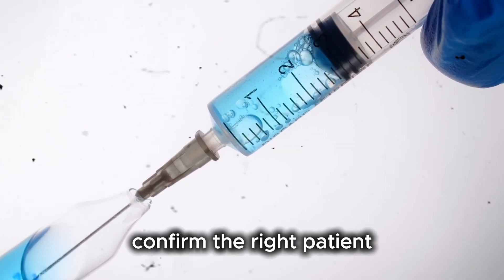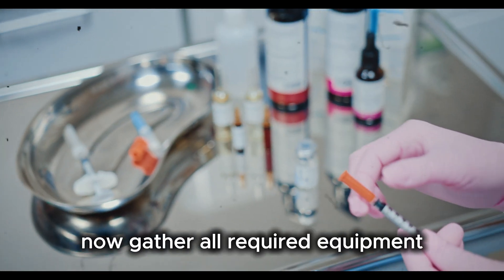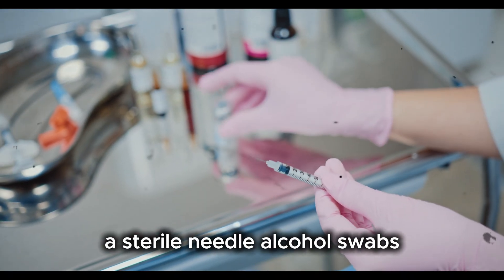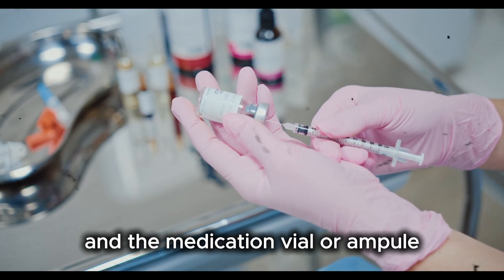Confirm the right patient, right drug, right dose, right route, and right time. Now gather all required equipment. You will need a sterile syringe, a sterile needle, alcohol swabs, cotton or gauze, gloves, a sharps disposal container, and the medication vial or ampule.